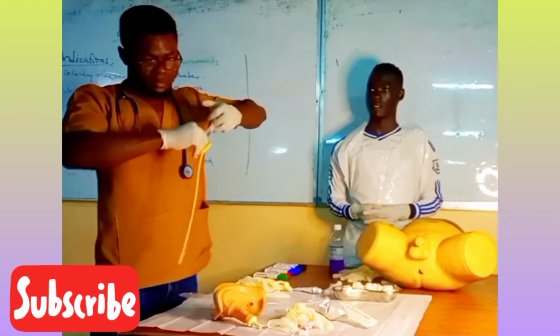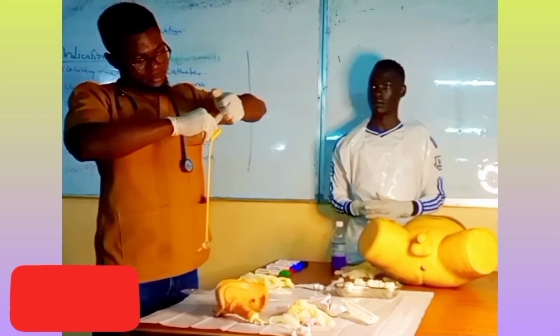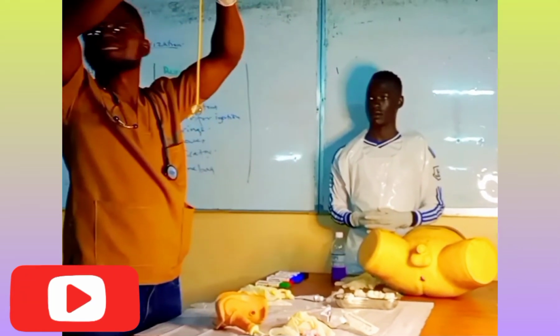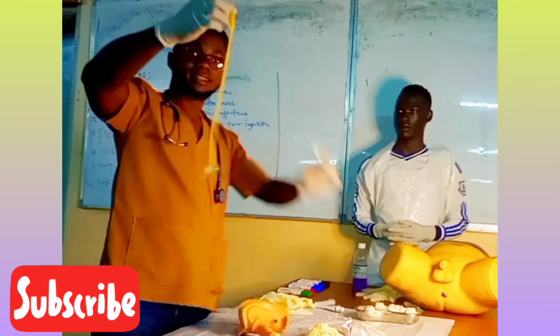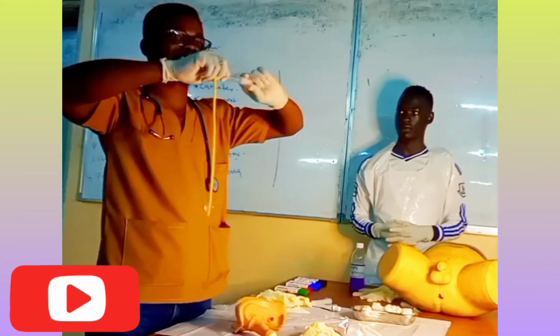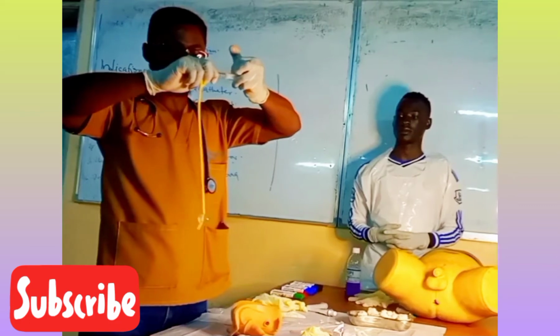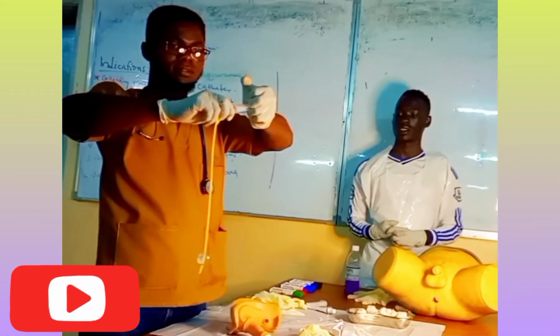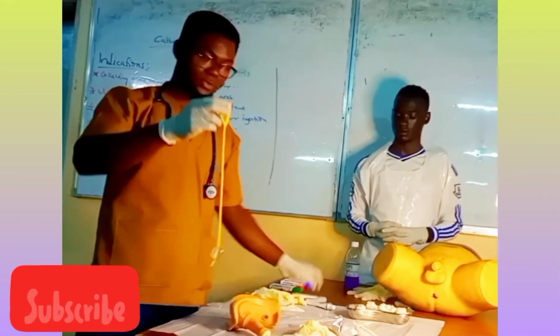Are we together? Yes. Then you push our water. Are you seeing what is happening? Are you seeing that balloon being formed? Yes. Then you get the second one. We said it can accommodate up to how many milliliters? 30. So I'll put the first 10, then this is the next 10. Next 10. Now these are 20. Normally we put 20 to 30.